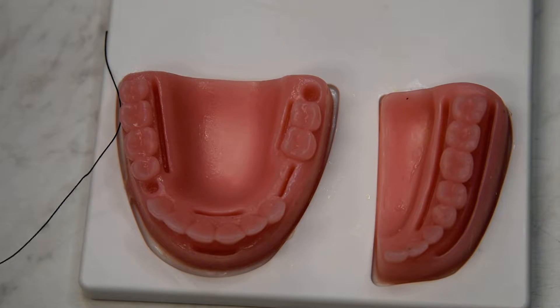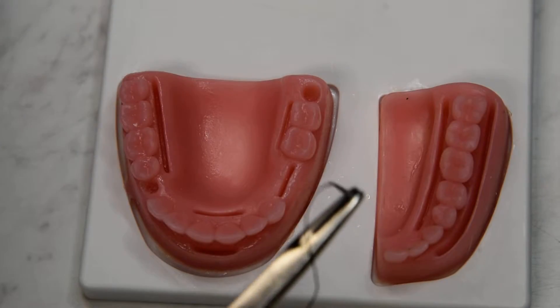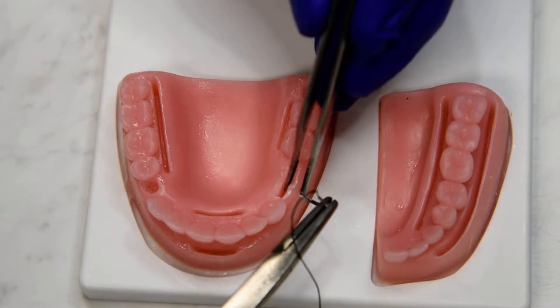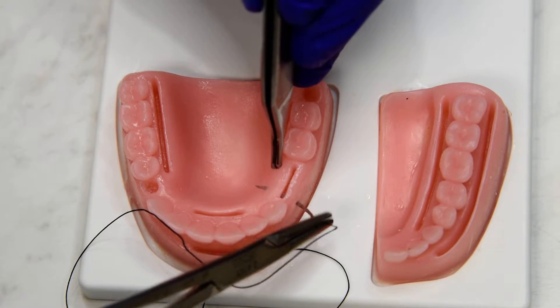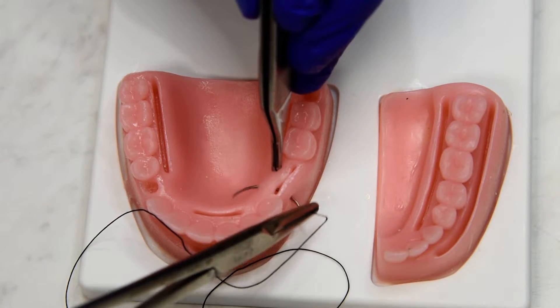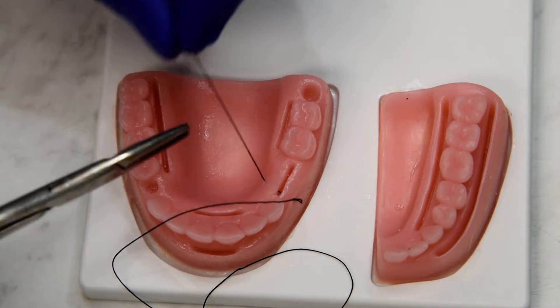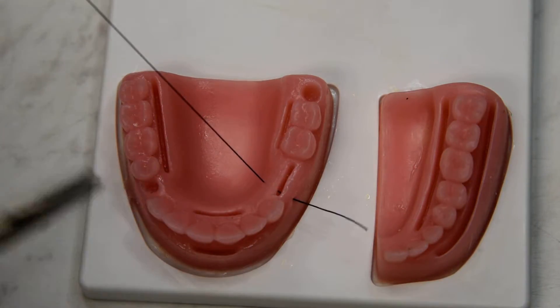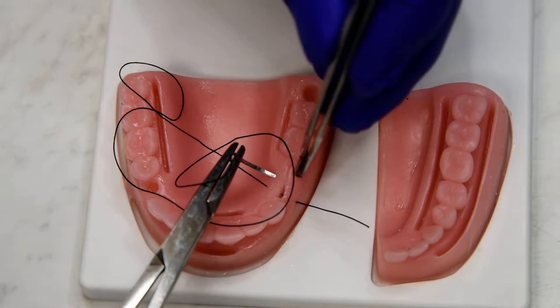A variation of the horizontal mattress is the Laurel Gottlau, which begins the same as a standard horizontal mattress — from the buccal to the lingual, about 5 to 7 millimeters apical, and back from the lingual to the buccal at the same depth.